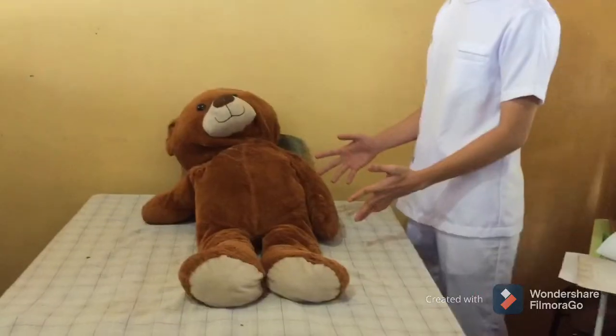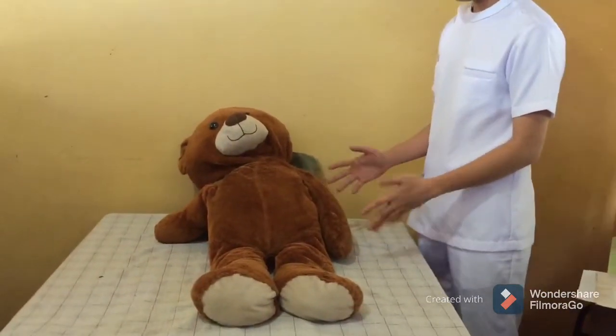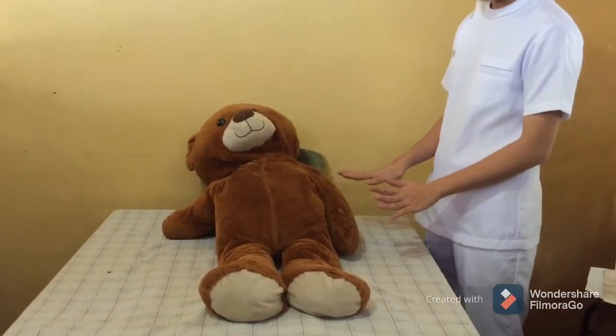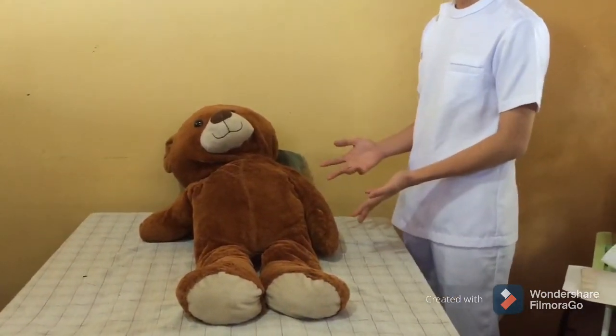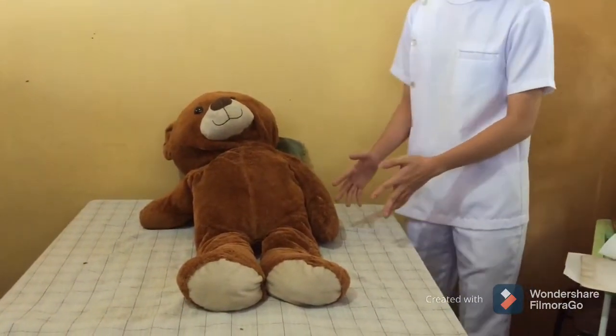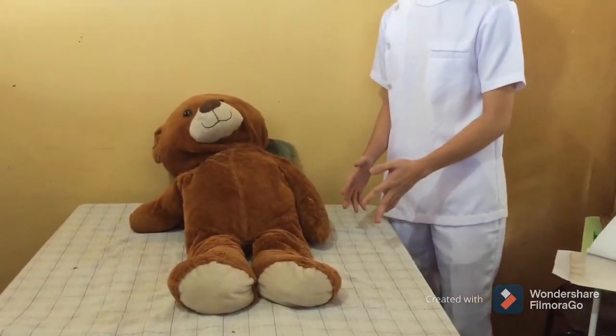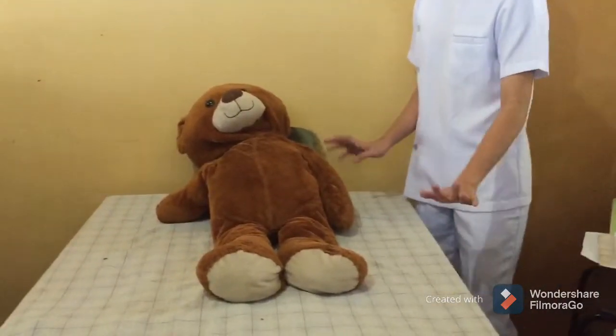Then, we are now going to provide privacy by draping the curtains. We need to do this so that we can gain trust and cooperation from the client. Then we select and clean the site. Avoid using sites that are tender, inflamed, or swollen, and those that have lesion, because these conditions will hinder the absorption of the medication. Then we are now going to put on our gloves as indicated by agency policy so that we can protect ourselves from getting contaminated.